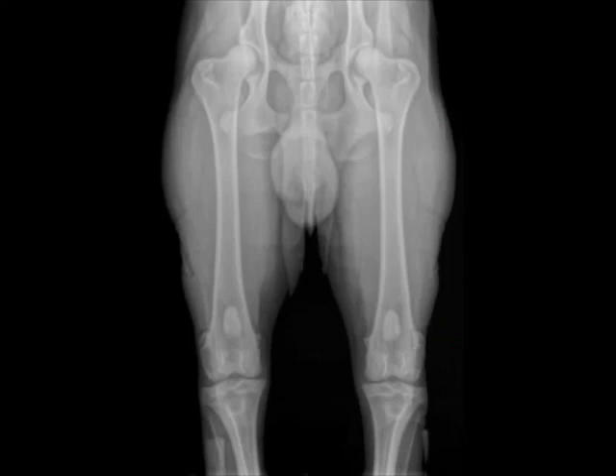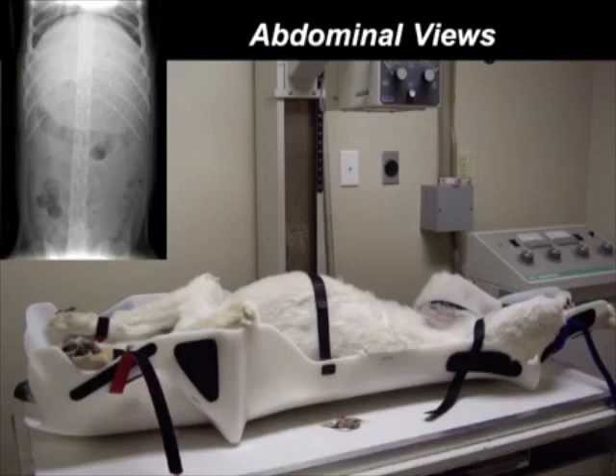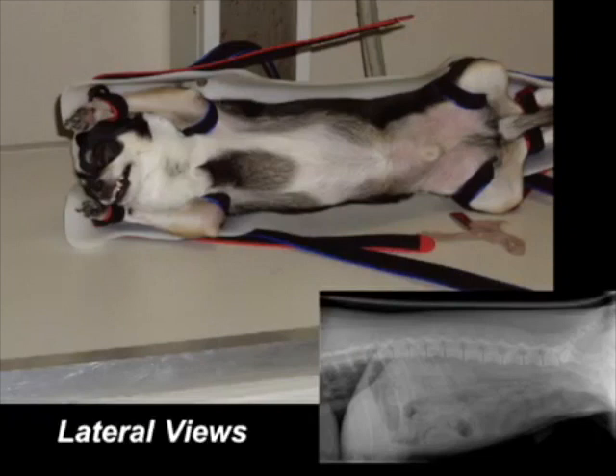Here are a few other easy applications on sedated or anesthetized patients. And once you're finished with a procedure, the Positioner serves as a stretcher to transport the patient back to the recovery cage.